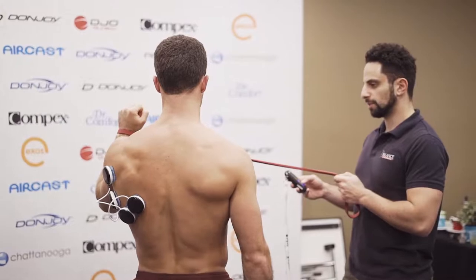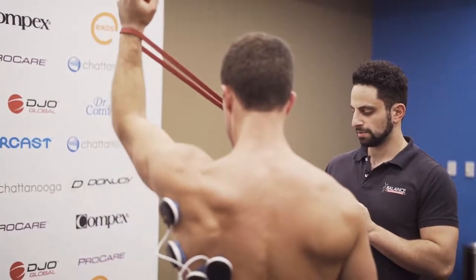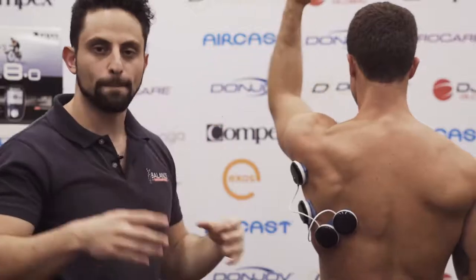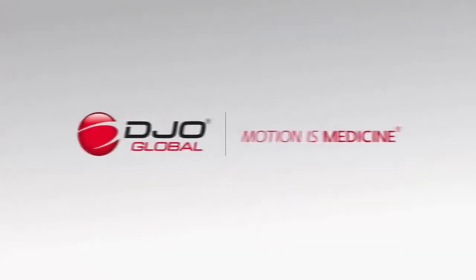There are other applications using accessories such as bands and therabands that you can use to resist the pressure a little bit more. And as you can see here, we're maximizing the recruitment of the fibers to maximize the muscle contraction. This is going to give the brain a little bit more awareness of where the latissimus dorsi muscle is.